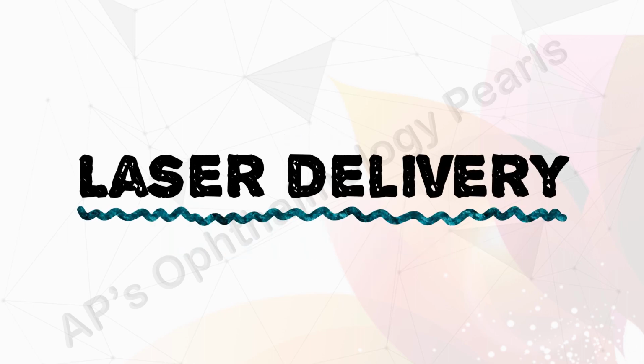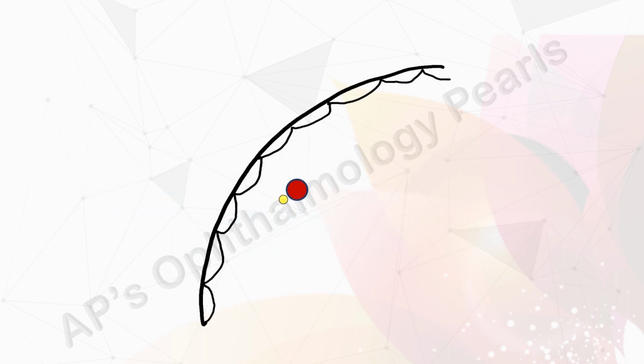Now, coming to the actual lasering. The anterior margin of the break is photocoagulated first, as this part is more difficult to visualize and the patient may cooperate better during the earlier stage of the laser session. An initial single row of spots with an interval of 1/4 spot size is given. A total of 2 to 3 nearly confluent rows must be placed around the break.